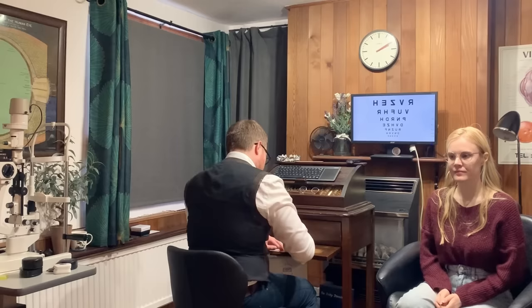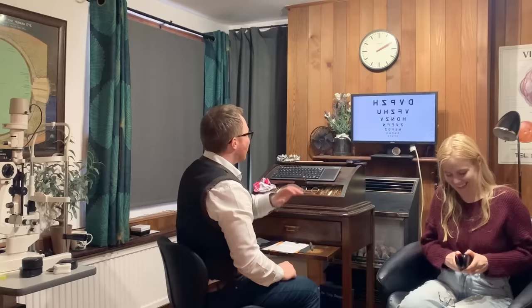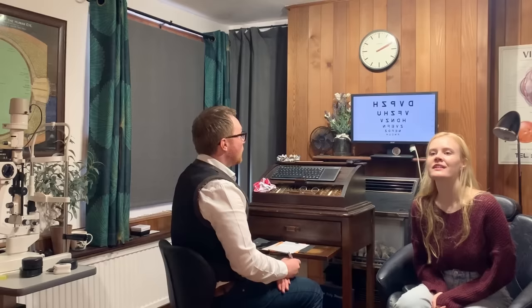Right, I'll get you to take your glasses off now. Probably make those letters a little bit blurry, don't worry. And having a look at the letter chart now, what would you say is the smallest line that you can get there for me? Really good question. Either the second or the third. Okay, yeah, should we have a go at the second one to start with?